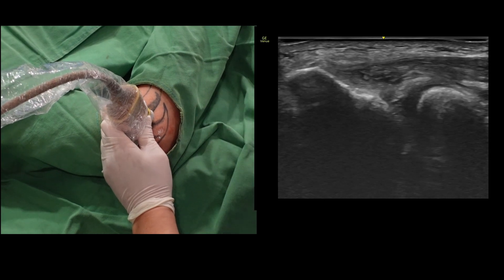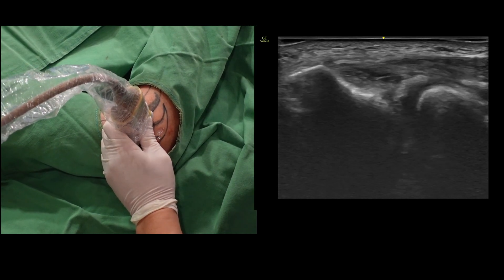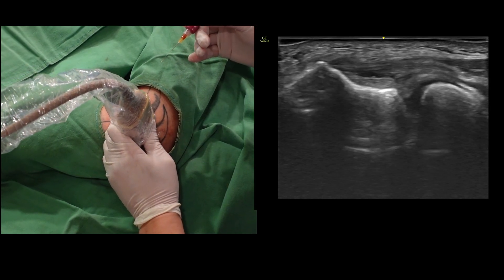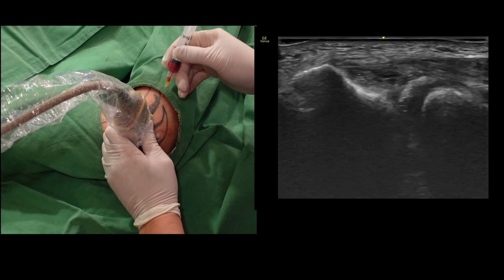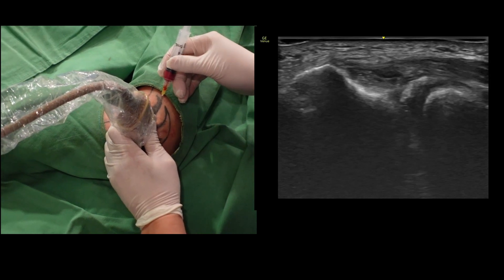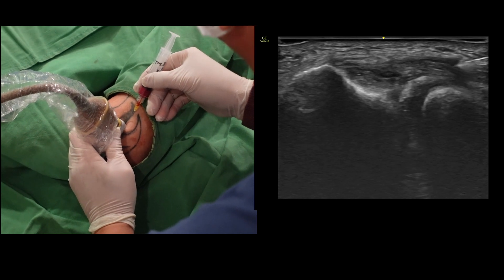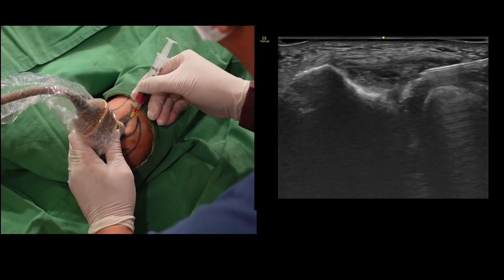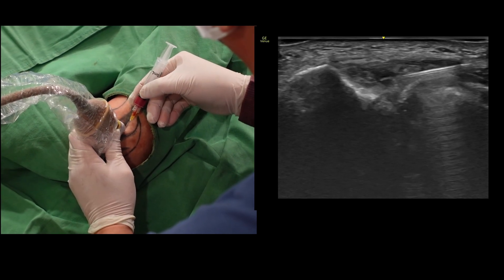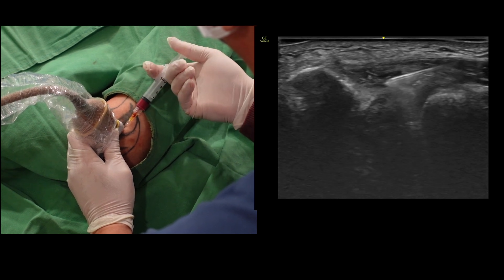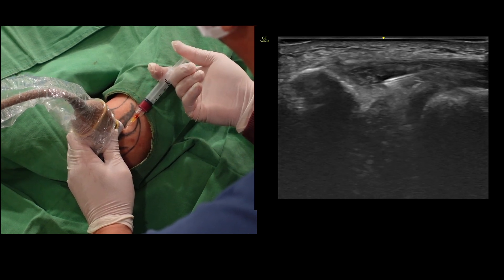During the procedure, I will puncture the tendon and inject a whole blood mixture into the torn area. You'll observe me repeatedly pushing and pulling the needle, redirecting it while administering the fluid. Rather than focusing on the process, pay attention to the structures where I inject the fluid and the hydrodistension of the torn area.